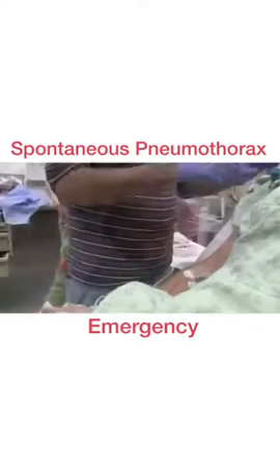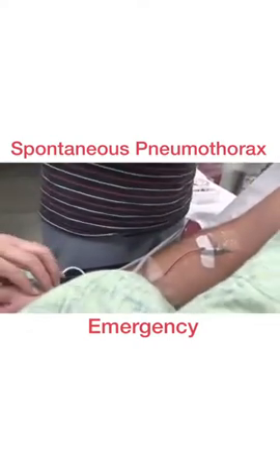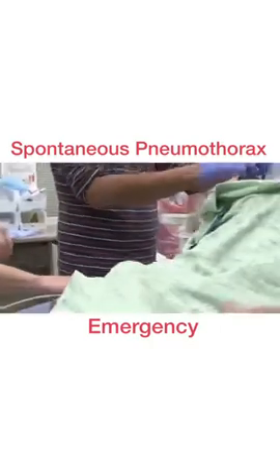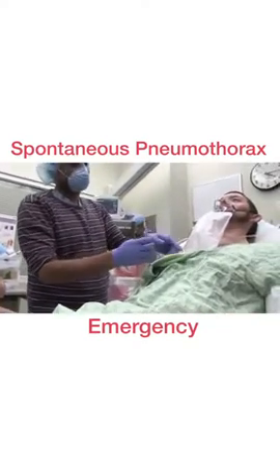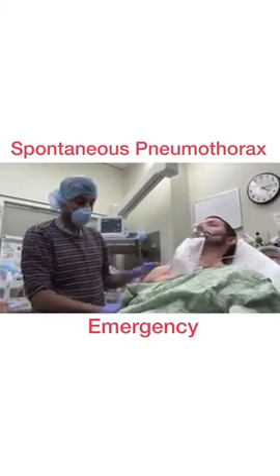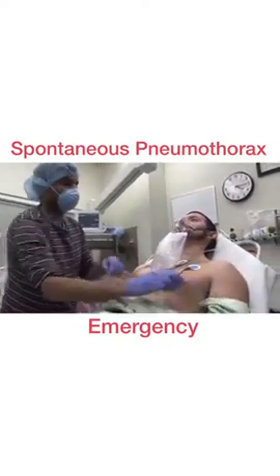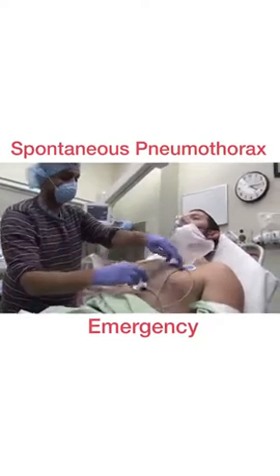Okay, all right. So Adrian, what are you giving as far as pain medications? So just pre-medicating for anxiolysis with 1 milligram of Ativan IV and also with 25 of fentanyl IV. We're going to hold an additional 25 of fentanyl for further analgesia if needed for the procedure. Okay. Patrick, you have no medical problems of any kind? No, sir. Okay.